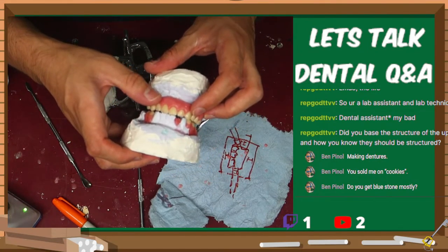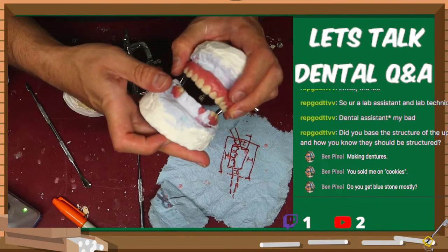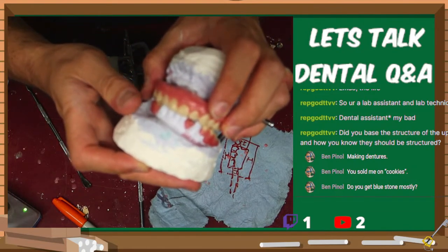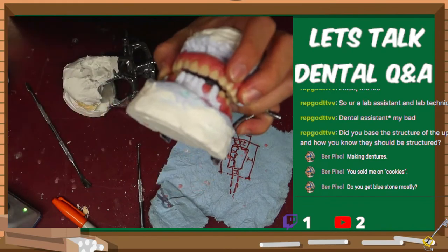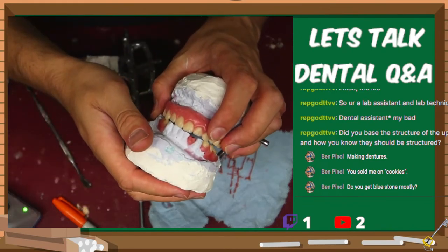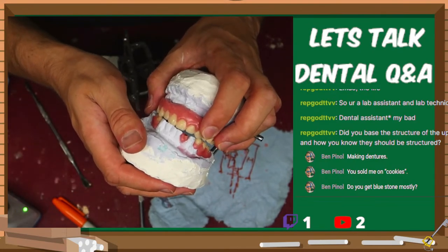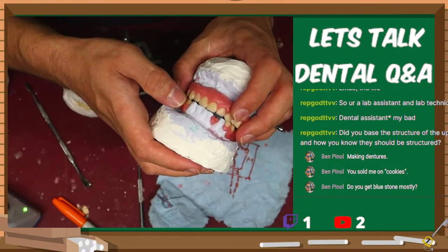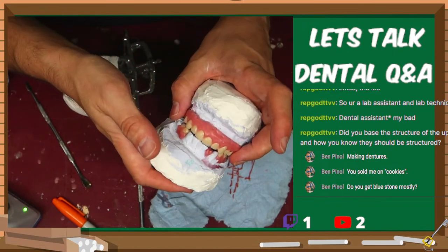Now with this person, what they wanted me to do is they didn't want me to make it where the top teeth sit in front of the bottom teeth at all, which is usually our natural biting state. They want to make this person more what's called end to end, where the top front teeth bite against the bottom front teeth and just meet the incisal edges, the ends of the top to the ends of the bottom. And they want it to stick like that. And that's fine, I can make it like that.